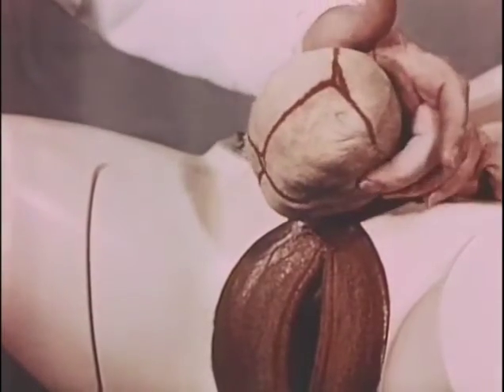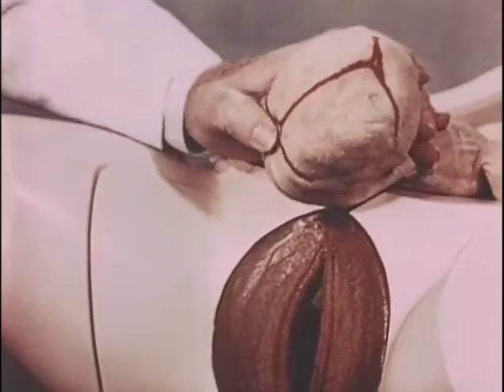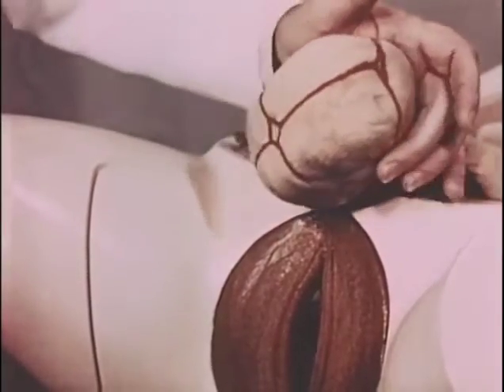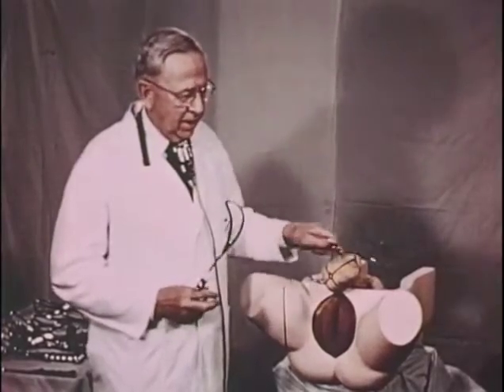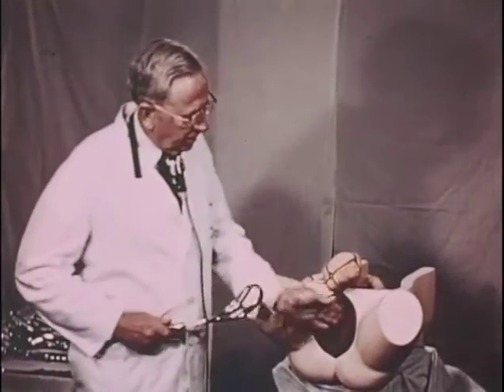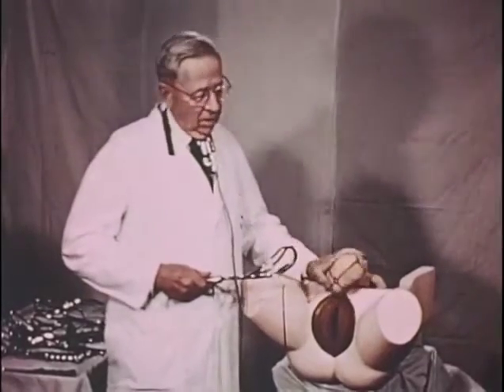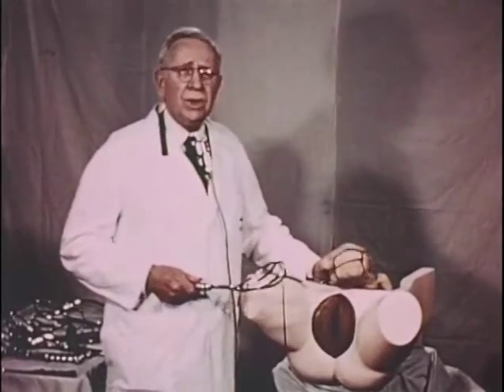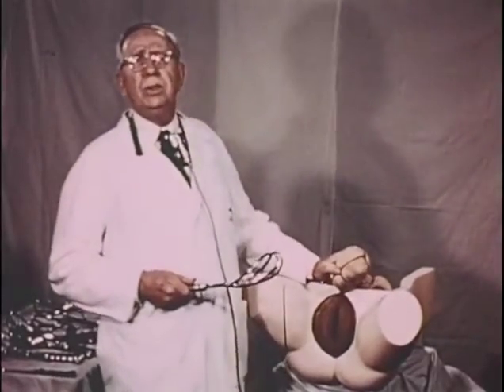That means that the left ear is posterior, and that brings up the four cardinal points of left ear, left blade, held in the left hand, and introduced to the left side of the mother's pelvis. We know that in all left-sided positions of the occiput, the left ear is always posterior.